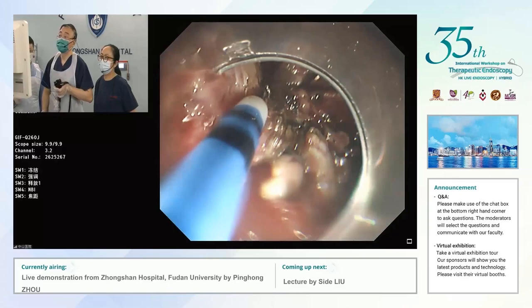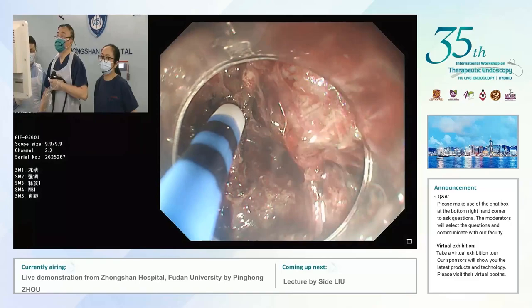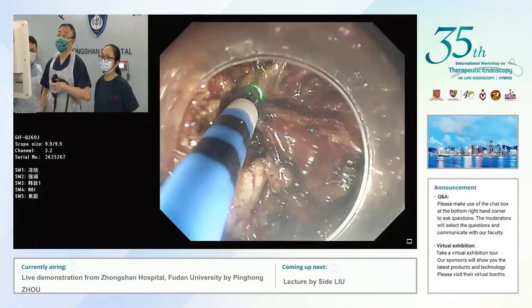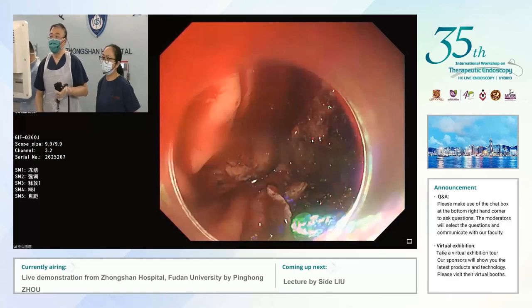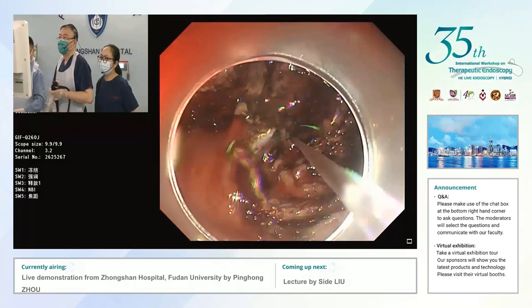After you finish cutting, are you planning to close the defect? Yes, I want to use the end loop and several clips to close the wound. The lesion was totally removed. It was very difficult — a lot of bleeding from the lesion. Before this live demo, I spent two hours preparing, and now we can say there was no bleeding in the wound.